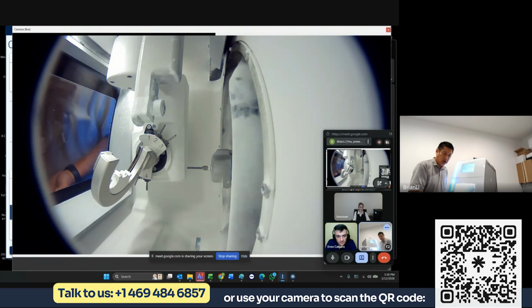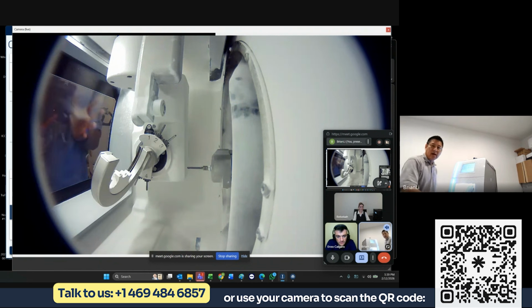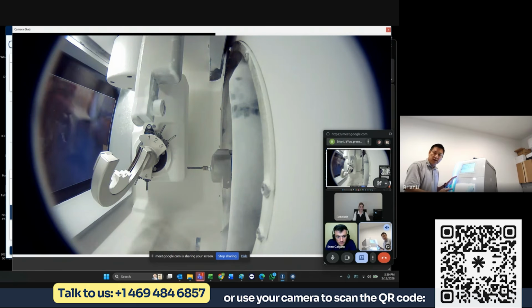most cases. So from a troubleshooting perspective, that's why we put the cameras in here, but also if I'm in the house and something is milling, I can now turn on the camera live and watch what's going on in addition to using it as a troubleshooting tool. So all of our mills have these cameras and the capability of recording.